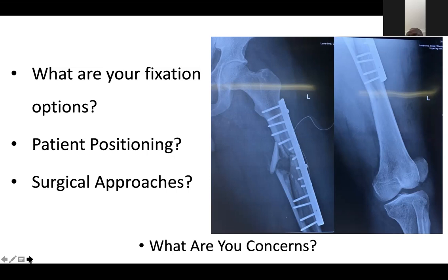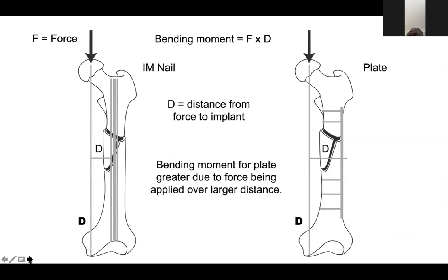We are spending a lot of time discussing this x-ray. This is entirely wrong. The treatment given here was wrong. And I don't think we should count the number of screws or anything. It's wrong. Even if you put 20, 30 screws, whatever. I mean, this is a diaphyseal fracture. We know the principles. I think let's move on and discuss what we should do. Thank you very much. Okay, thank you, sir.